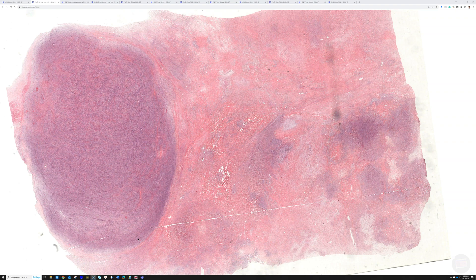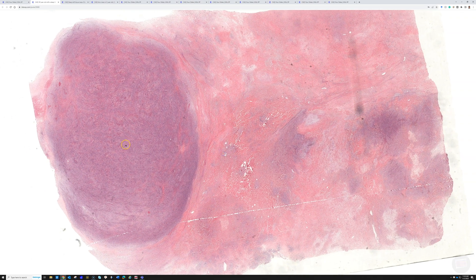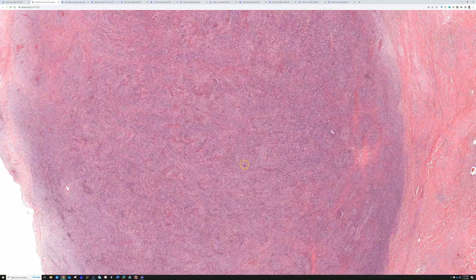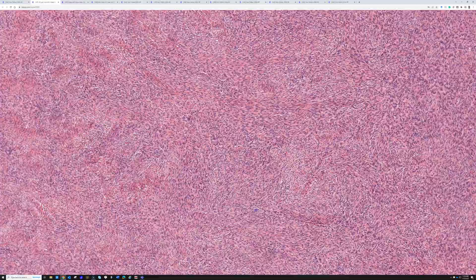This is the first case. It's a large deep soft tissue mass in an adult, and you can see there's a lot of variation from low power. I'll record this and put it on YouTube with links to the virtual slides at some point in the near future. Here we can see a cellular nodule in this area.